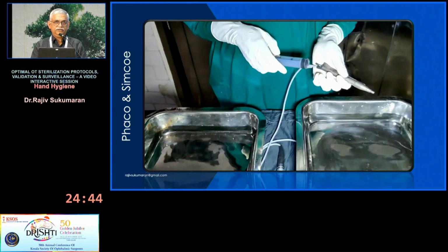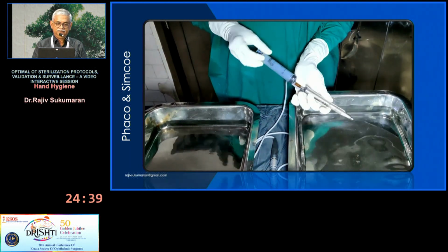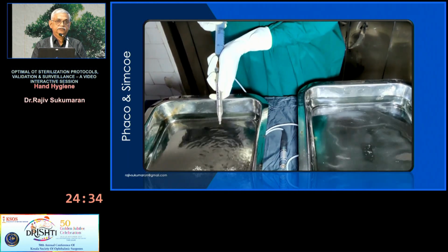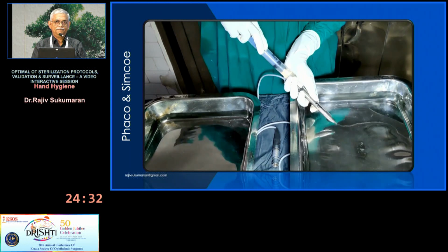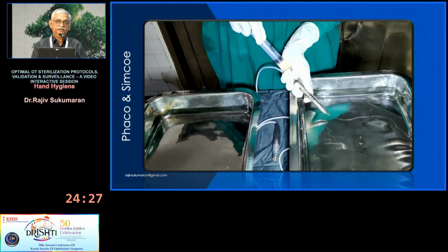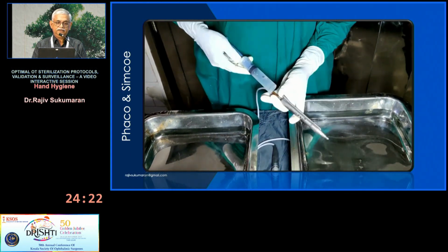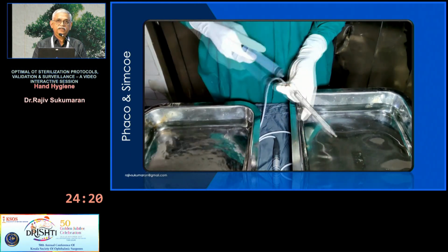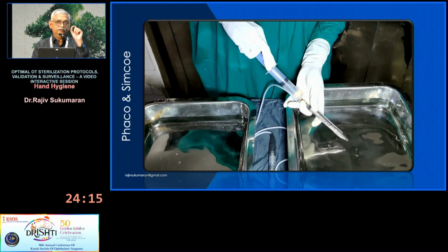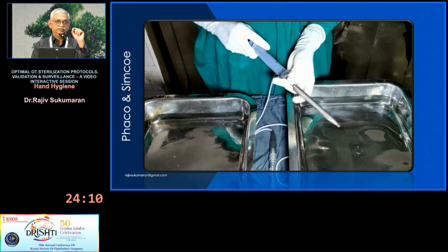Coming to the cleaning of the phaco handpiece, usually what we do is like this. Just aspirate like this and push it. Is it correct? No, this is not the proper way of cleaning your handpiece. The best way is unidirectional. If you are sucking, only suck. Don't push again. It should be in the direction of the flow as you do surgery.